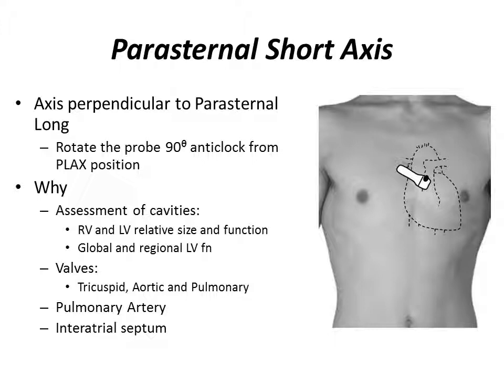Again, I would not go into the details, but it suffices to mention at this point that you are able to ascertain the regional and global LV function in this view. You're able to ascertain the contractility at various levels. There are a lot of valves that you can see in this view.